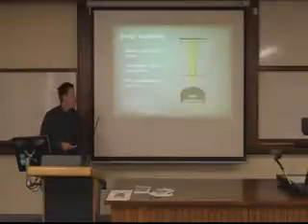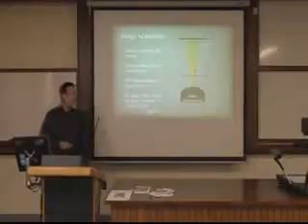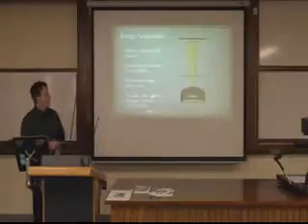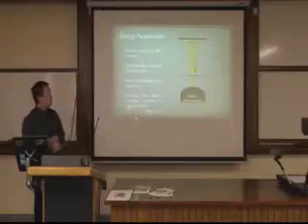And because of the way the interaction between the energy of the treatment beam and the EPID characteristics, there's a banding artifact, and so to remove that banding artifact, we use 3-frame averaging. And so each image in the data sets that I use represents a 2-degree gantry rotation.